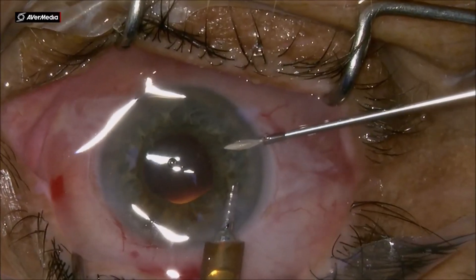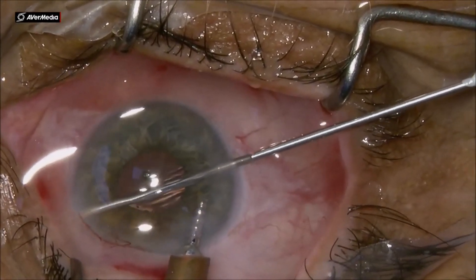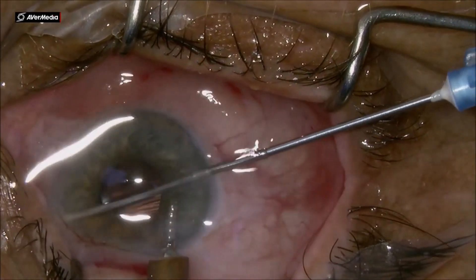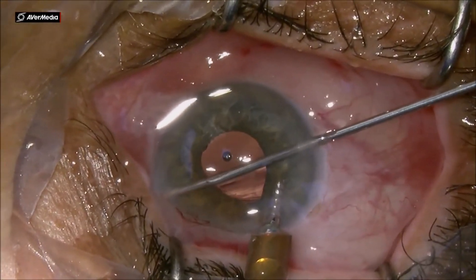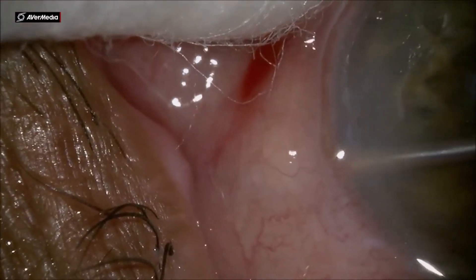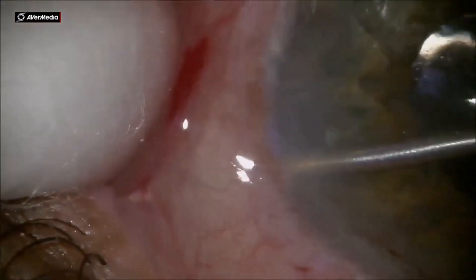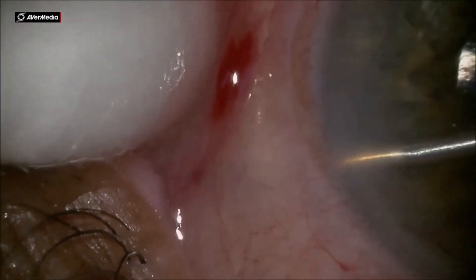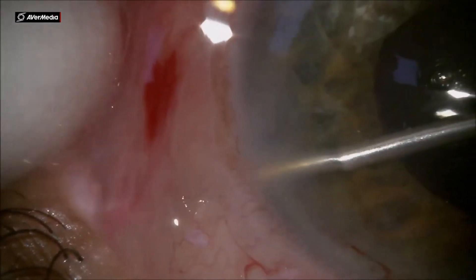The first case was the left eye, done with the left hand. The second case is the right eye. The anterior chamber was maintained with viscoelastic in the first case. In the second case it is on BSS via an AC maintainer. In this second case the needle is a 23 gauge — a little smaller — because the IOP in this case is around 24 mmHg.